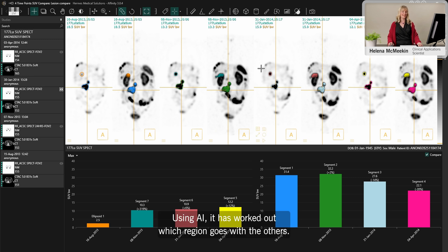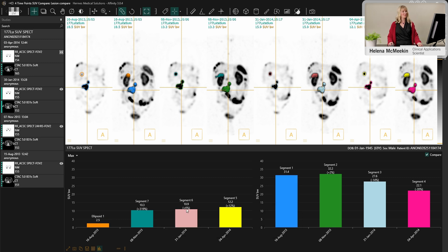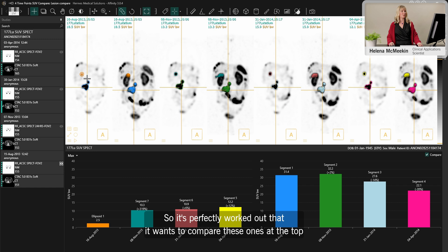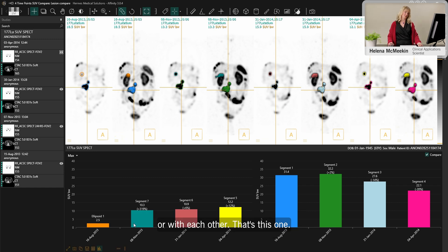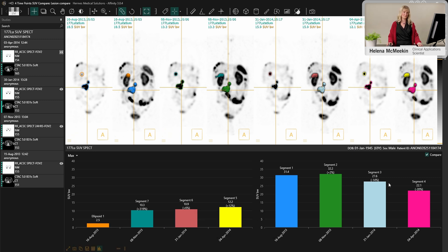Using AI, the software has automatically matched the regions with each other across time points, working out which region corresponds to which across all four scans. It shows the change in those regions compared with the previous time point, correctly pairing the corresponding lesions in the column chart.